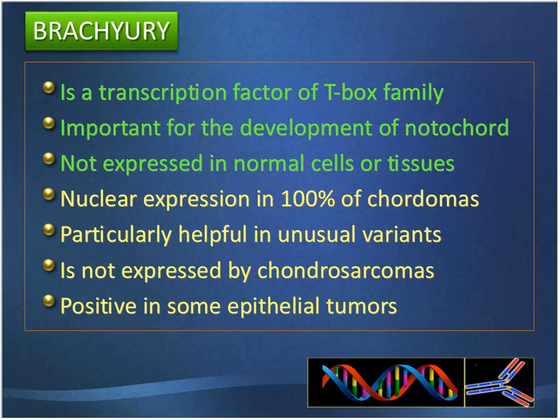In addition to chordomas, they could be positive in some epithelial tumors. The staining, however, in those few epithelial tumors is very focal, whereas the nuclear expression in chordomas generally is universal.